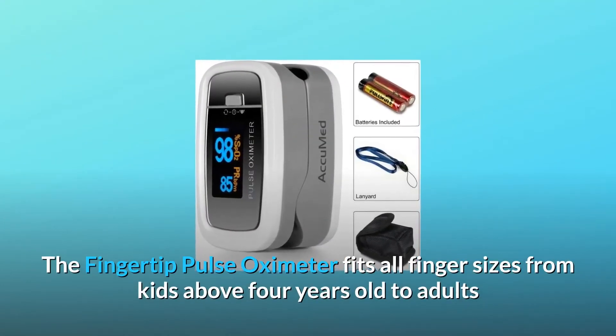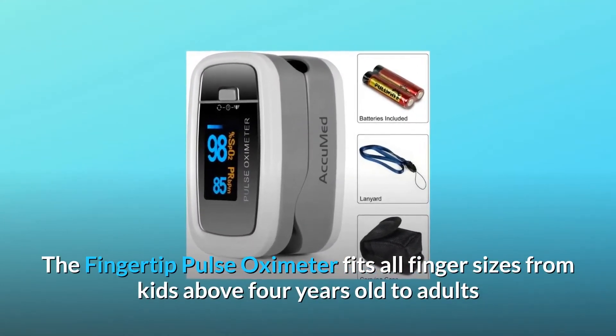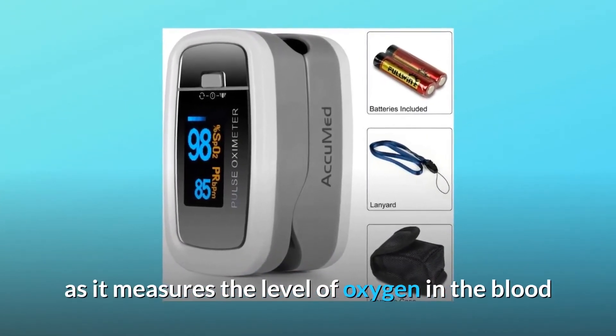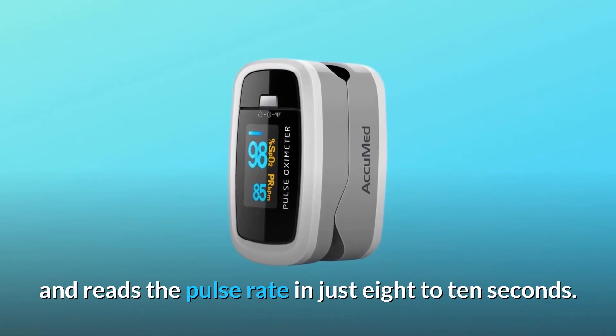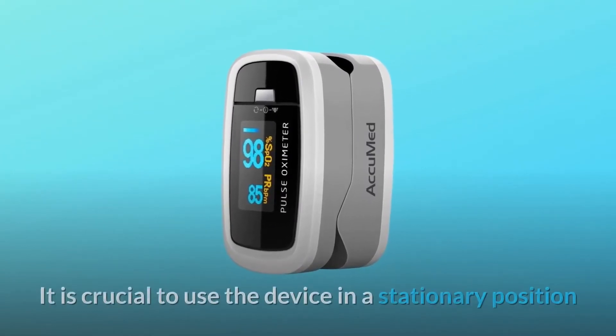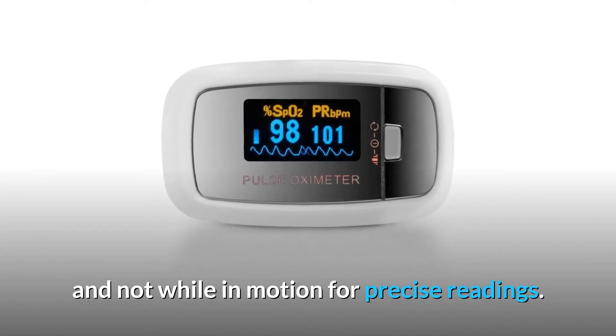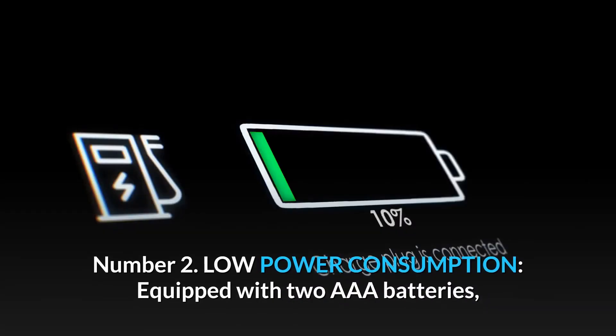The fingertip pulse oximeter fits all finger sizes from kids above four years old to adults. It measures the level of oxygen in the blood and reads the pulse rate in just eight to ten seconds. It is crucial to use the device in a stationary position and not while in motion for precise readings.